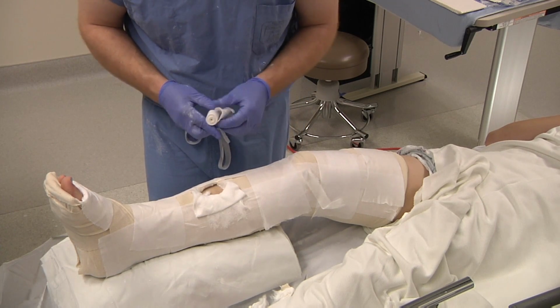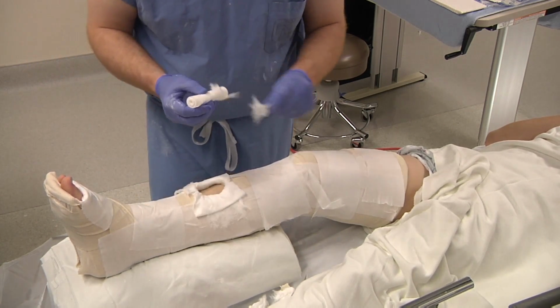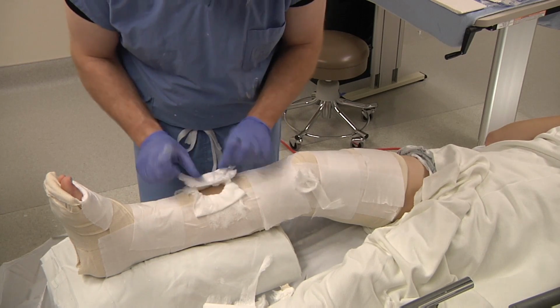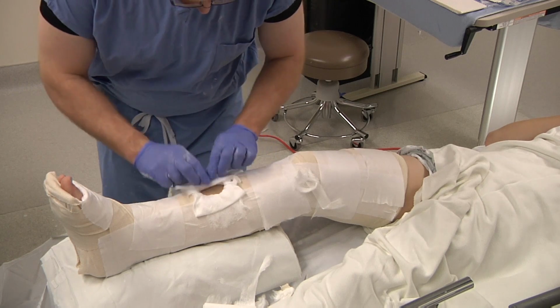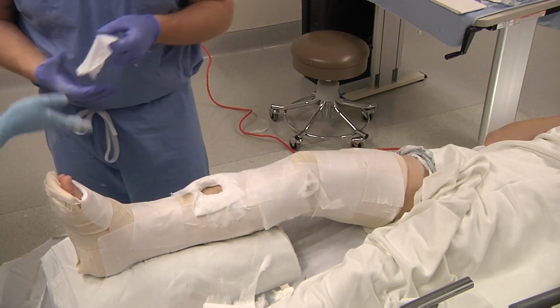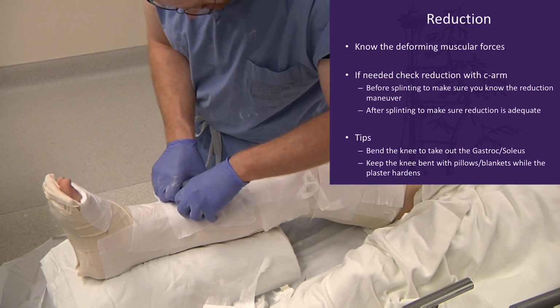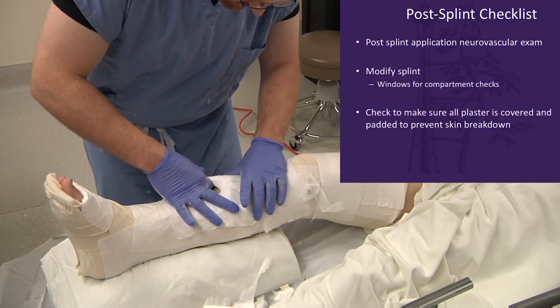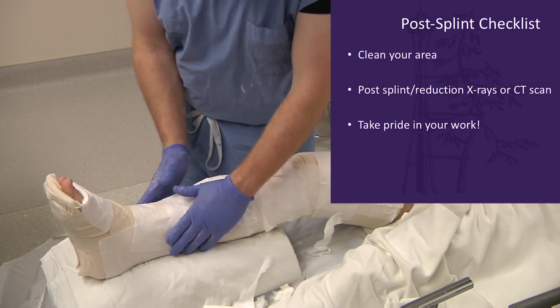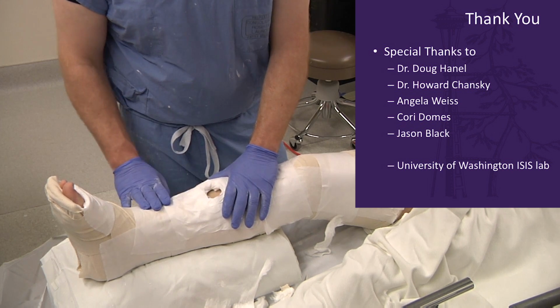Make sure your window, you might need several windows. Make sure your window is big enough so that you can do an adequate exam. Try not to waste resources too much. Easily frame out your window so it doesn't propagate any tears or breakdown in the plaster or your work. From there, you should be able to easily get around to evaluate your compartments. Always take pride in your work. That is a long leg splint with a window.